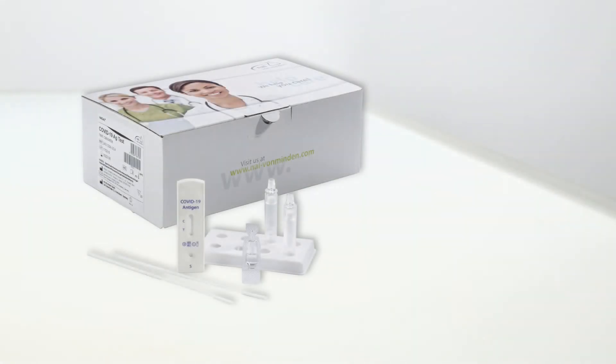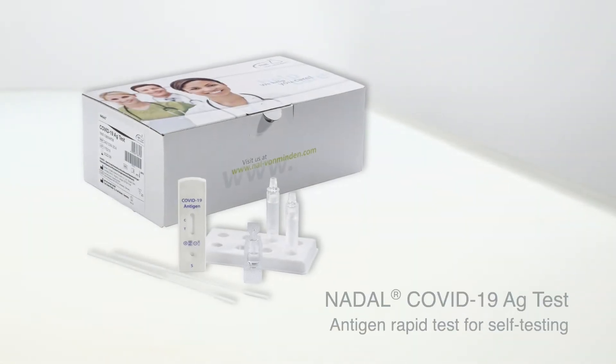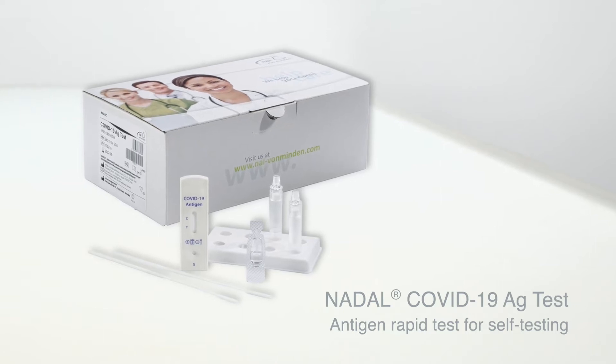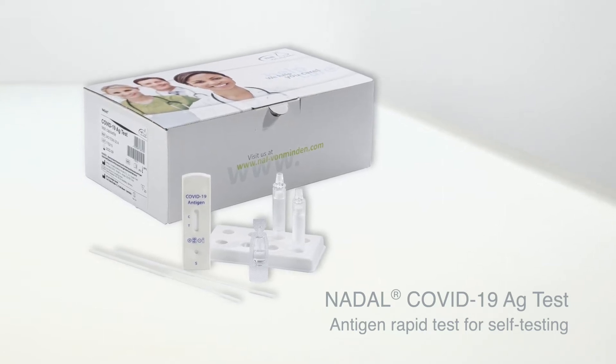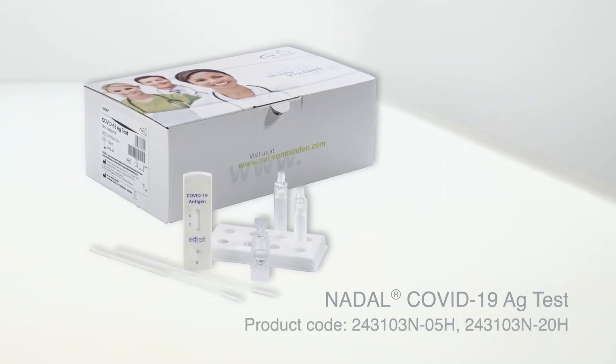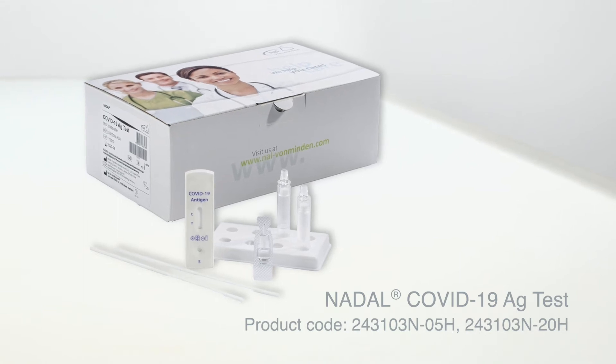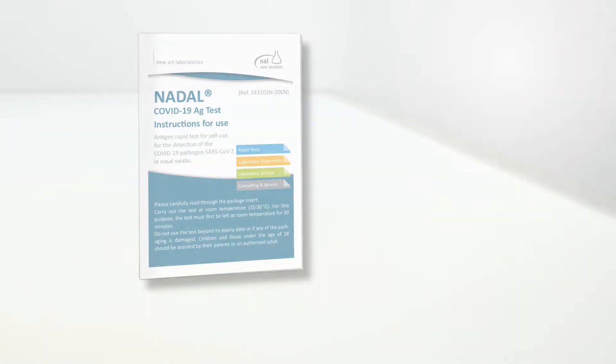The Nadal COVID-19 antigen test is used to detect the COVID-19 pathogen SARS-CoV-2 in nasal swab samples. This test is suitable for self-use.